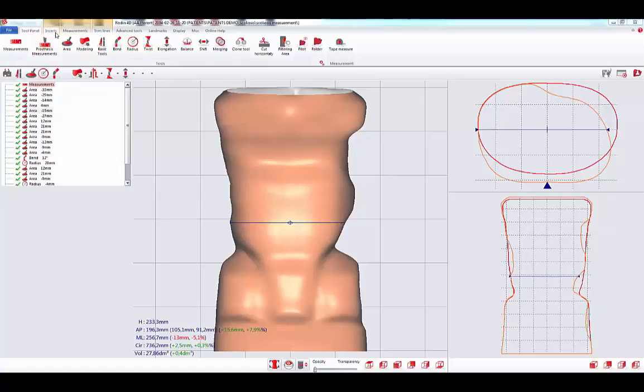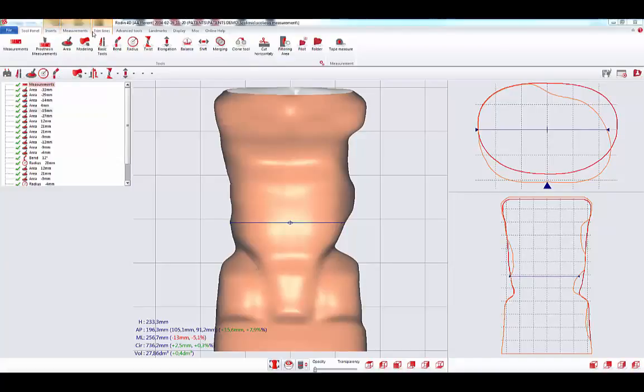In the three next tabs are the inserts, the measurements, and the trim lines. In the previous version, these tabs were above the tool list.